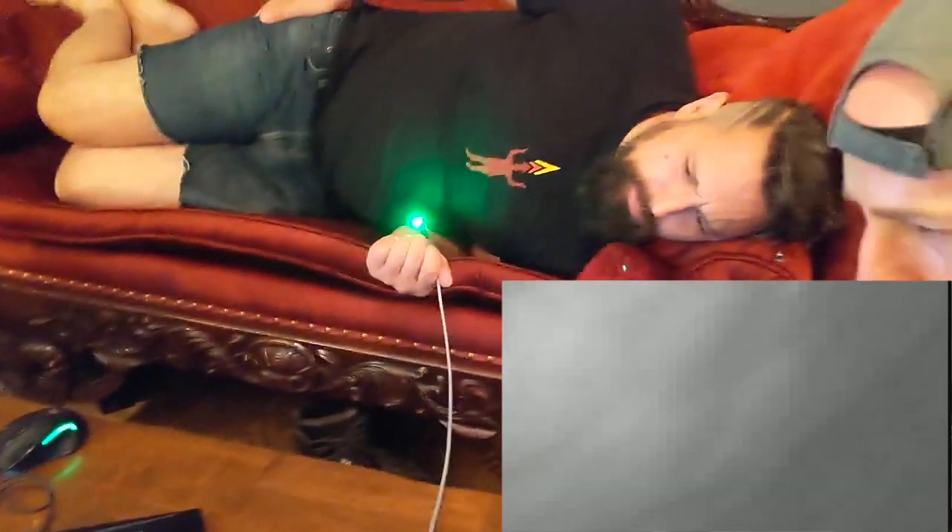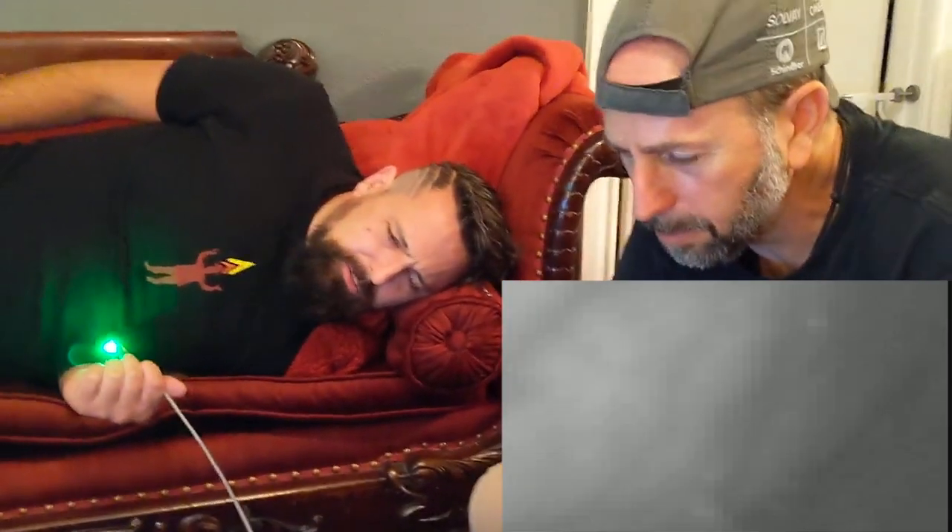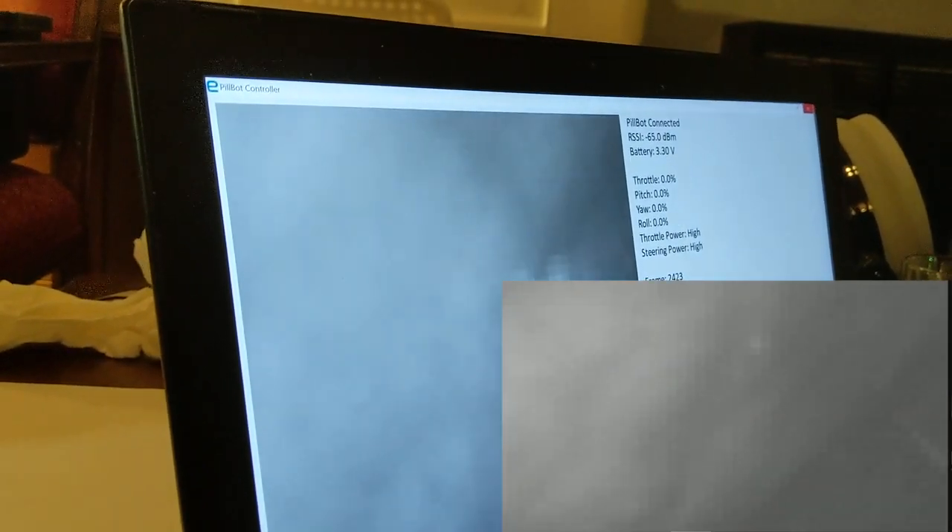I'm going to back up a little bit. Let's go forward. I wasn't sure what to expect, but this is kind of more — that's good resolution. It's like we're actually looking around. You can see some of the features of the surface. Is that the pyloric sphincter? No, he's on the wrong side. If he flips over on the other side, you might see it. If I stand upright, you'll probably have a look at the pyloric sphincter. The cool thing is you're actually moving around independent of me — I'm just sitting here.